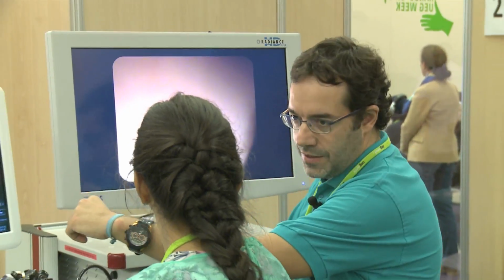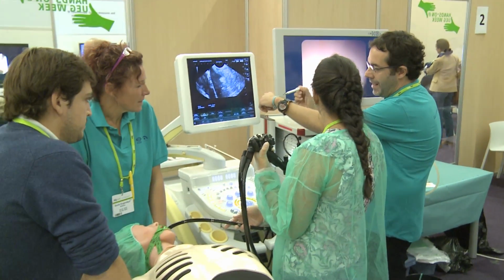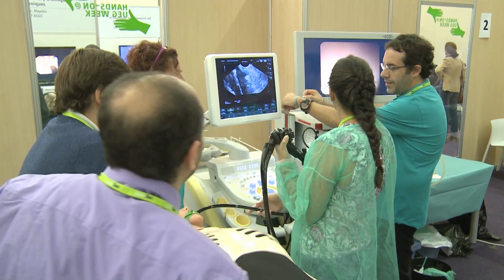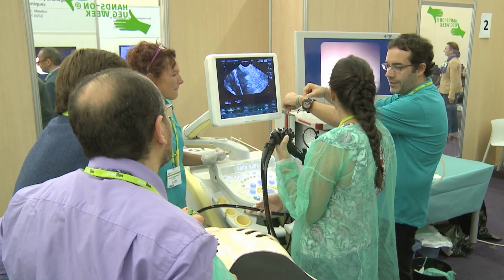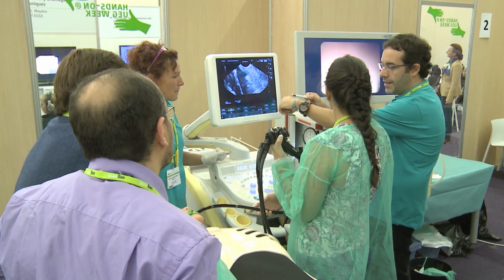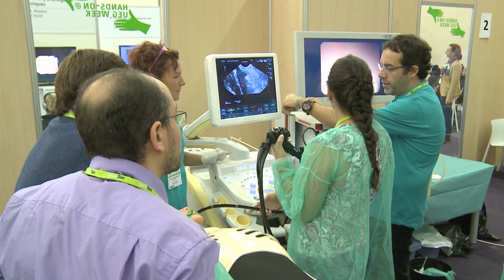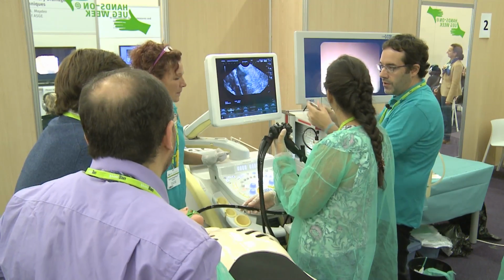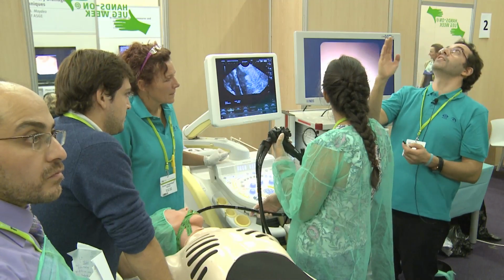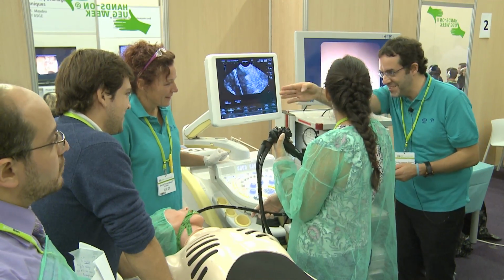If this is the pylorus, just as an example, and I want to go to the pylorus, I cannot go this way, because if I'm doing this, I am going against the stomach wall. So you need to look at the incisura angularis. If you look at the incisura angularis, the scope will really go this way, because the light is like this. ERCP is like this, EUS is like this, and normal endoscopy is to the front.